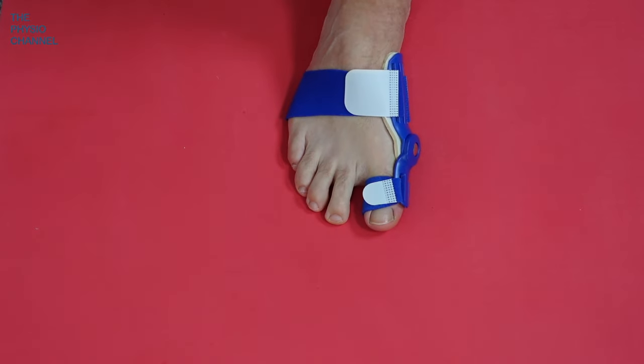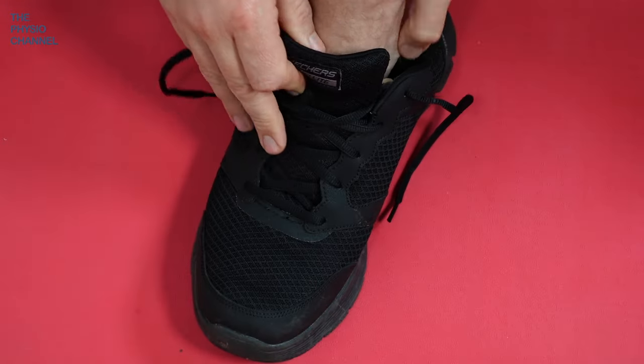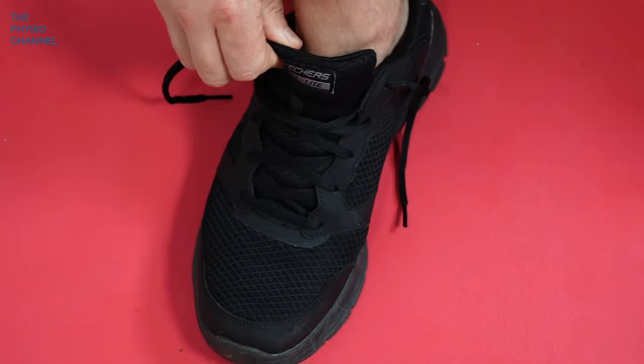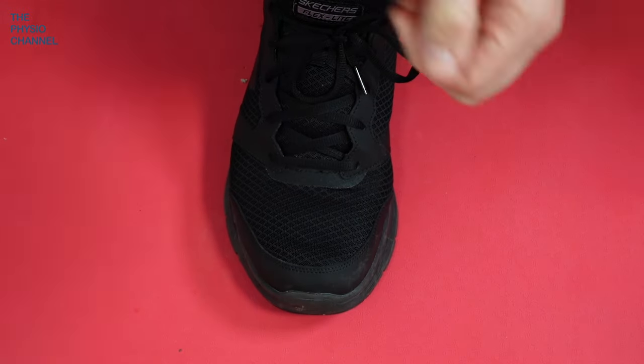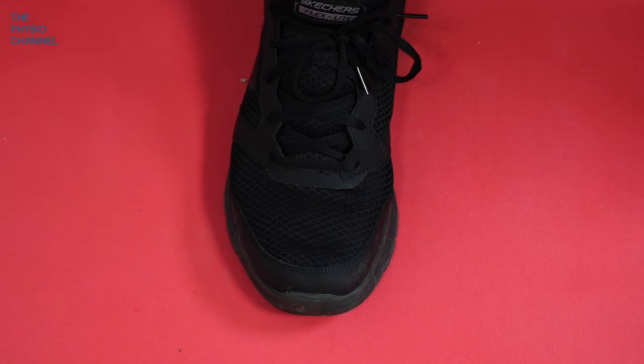I can easily walk barefoot and it doesn't cause any restriction. These are apparently designed to fit in a shoe. I'd certainly recommend putting it into a nice soft trainer with a wide toe box, rather than narrow shoes or stiff leather shoes where it might be harder and more uncomfortable to fit the dynamic hinged orthosis.